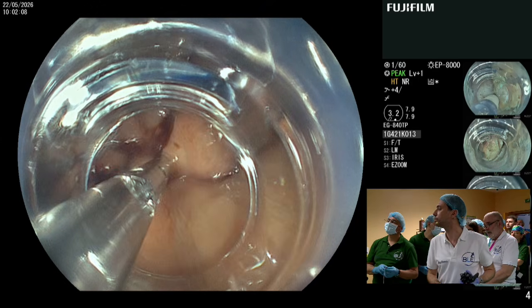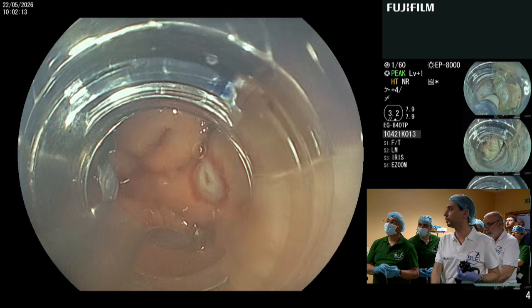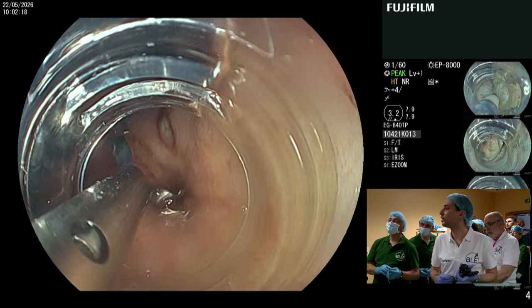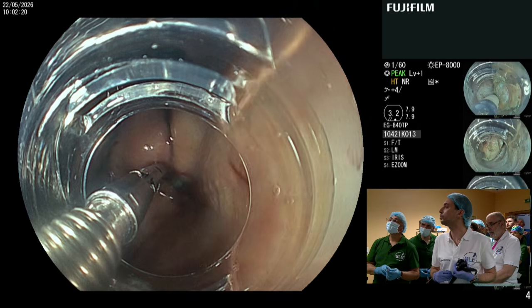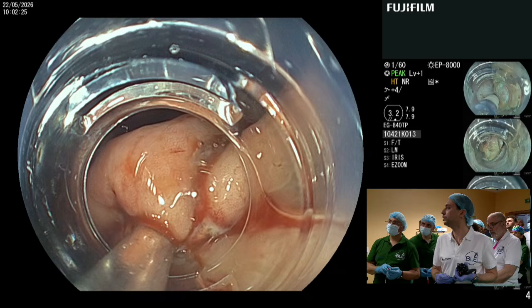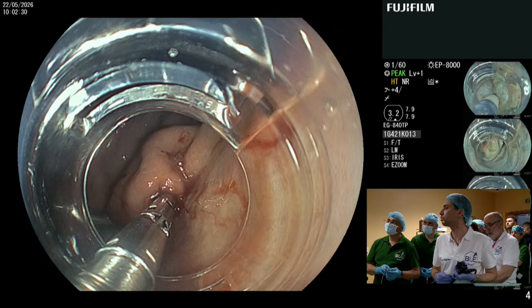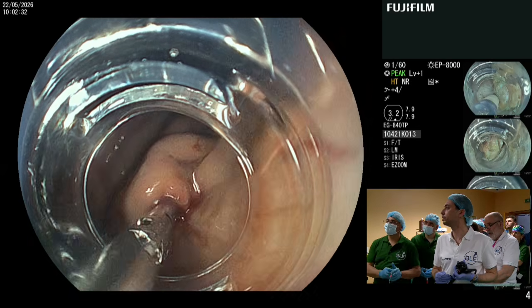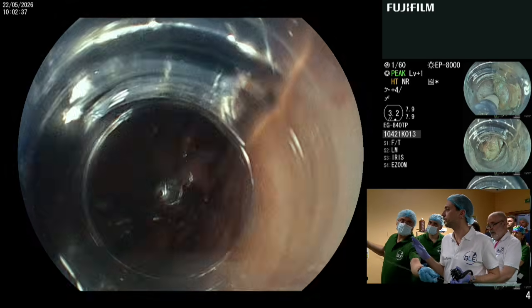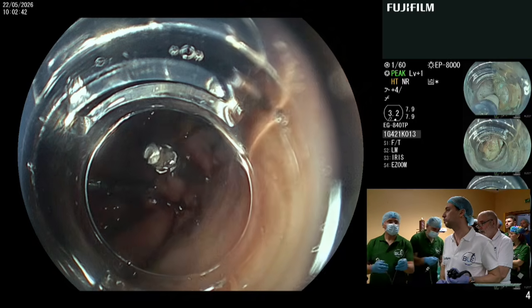Close. No. Okay. Open. It's not good. I will do the same as before. So, I will try to grasp the edge. Close. Yes. Open. Close. Okay, it looks nice. Place, please. Fire. Okay. Give me, let's try again a conventional clip to see if we can, or shall we use the endoloop? Endoloop will be more secure, we have a perforation.